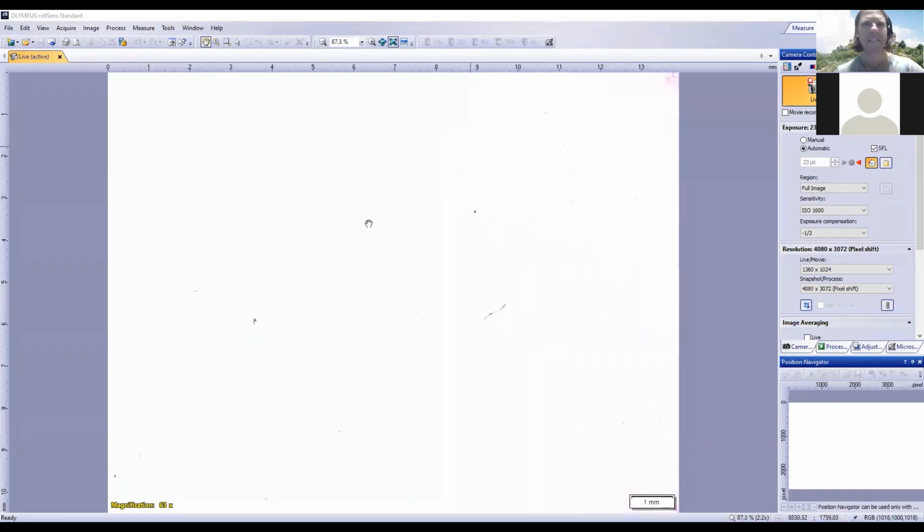So, Emily and Shubo, can you share your screen with the microscope camera and give us a short run through how these usually work? Yeah, we're just setting up. Okay, cool. So basically, the low power pathology says most of it, but yeah, there we go.